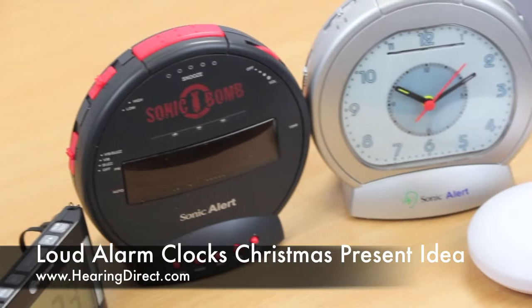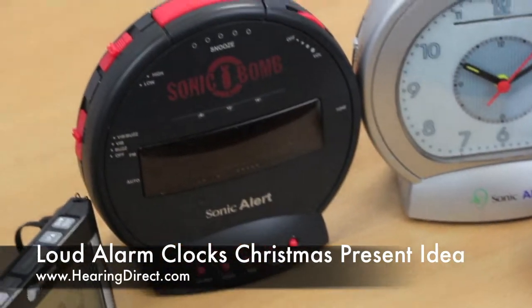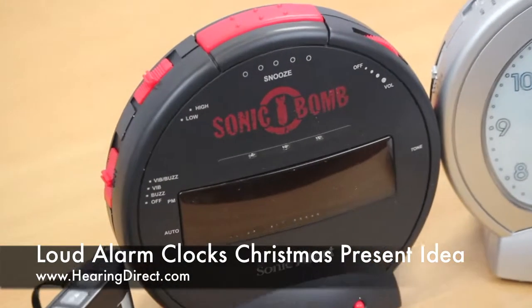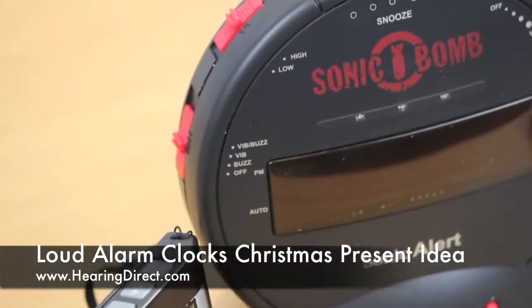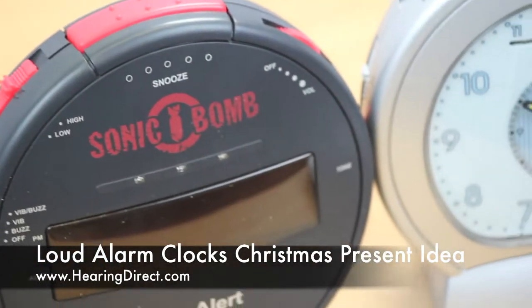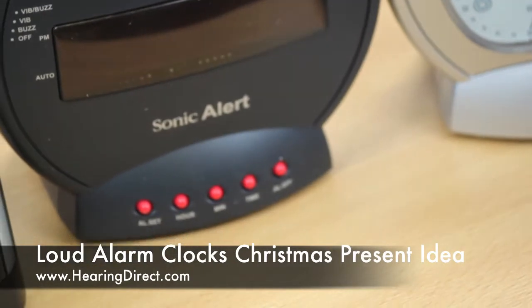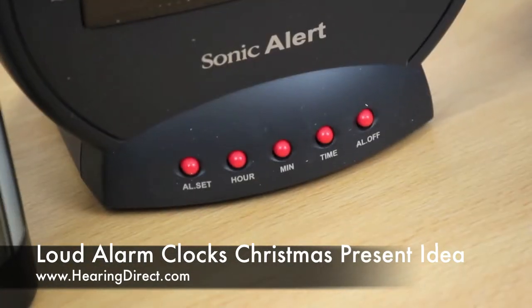The alarm clocks themselves are very simple to operate, fairly standard as alarm clocks go. They have snooze functions, some of them have flashlight functions for help at night, and they are set in very similar ways with volume controls. Some of them also have what they call tone controls, whereby you can highlight either the higher frequencies or the lower frequencies, depending on your hearing requirements.